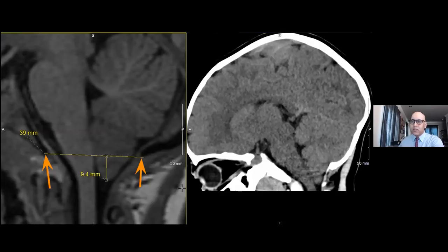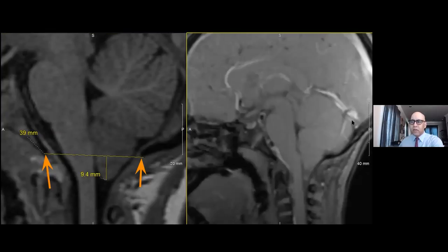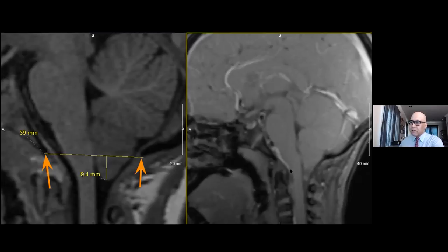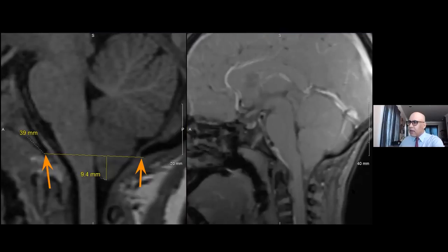But how do we determine how significant this is? Well, the extent of tonsillar descent is one mechanism, but another tool we have is CSF flow studies. This is a dynamically acquired cardiac-gated phase contrast image, acquired sagittally at the level of the foramen magnum. We can see the basic anatomic details that we see in the structural image, and as we scroll through the cine, we can see different phases of CSF pulsations.